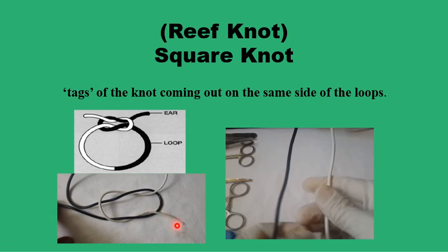If we don't reverse direction, we would get a very insecure type of knot called the granny knot, with the white ends coming up on both sides of the black loop and vice versa. This is fairly insecure.